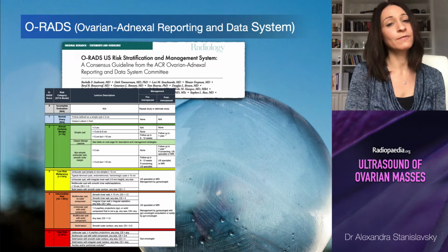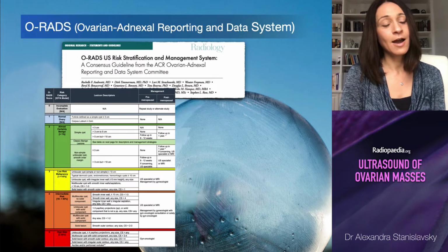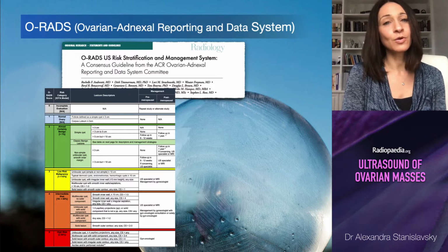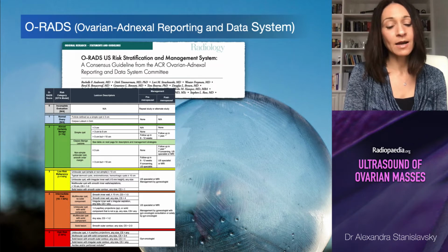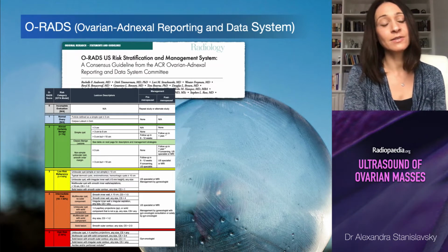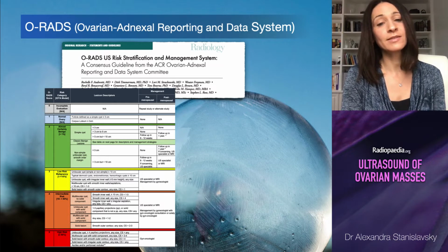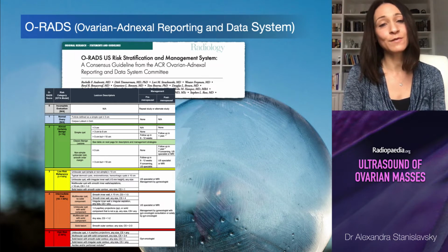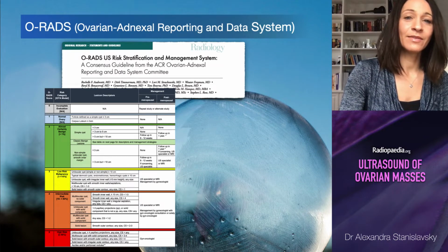I'm making use of the fact that this is a straight to DVD video. So please Google O-RADS ACR, and I think that should be sufficient. I would suggest having this alongside the talk for when we get to the tumor analysis and case analysis part of the talk. And feel free to pause, of course, as you do that.